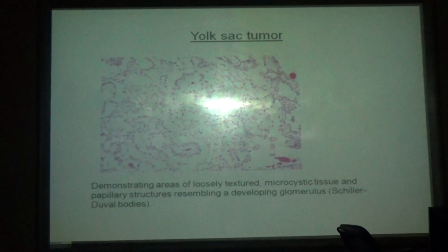Glomeruli. Very good, glomerulus-like. It resembles glomeruli. Okay, so I will describe this. It demonstrates areas of loosely textured microcystic tissue. This is all cyst.